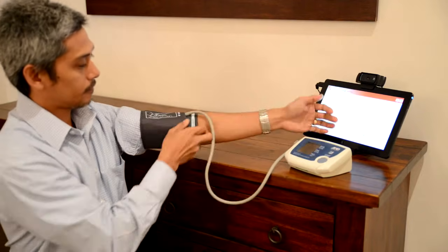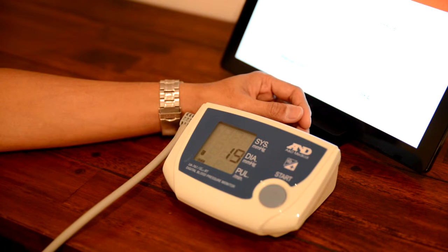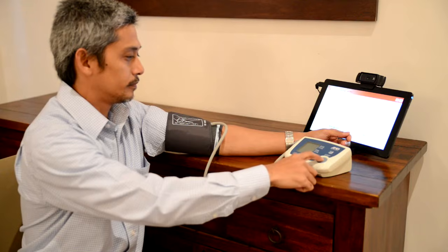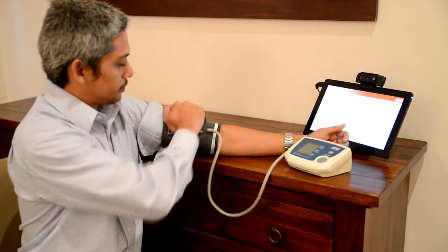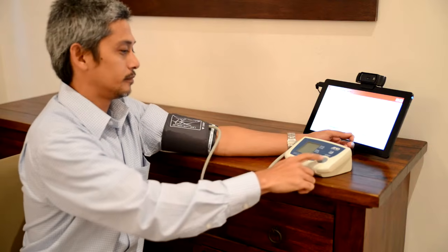Now rest your left arm on the table, press the start button on the blood pressure monitor and wait for the measurement to take place. It is quite normal for the cuff to get tight, but if alarmed you can press the start button again to release the pressure and allow you to readjust the cuff.